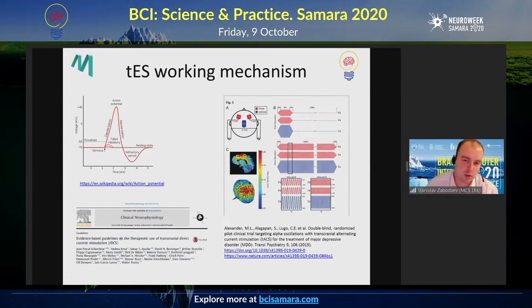This is the so-called resting potential. When there's an anodal stimulation, when you put an electrode over a certain area of the head which is connected to the positive pole of the electric stimulator, then the tissues under that electrode get the gradient of a direct electrical field, which sort of raises this potential of the resting state.